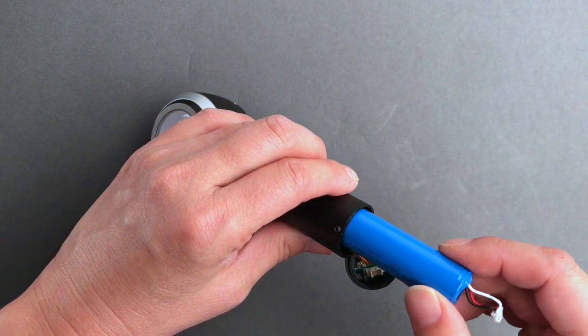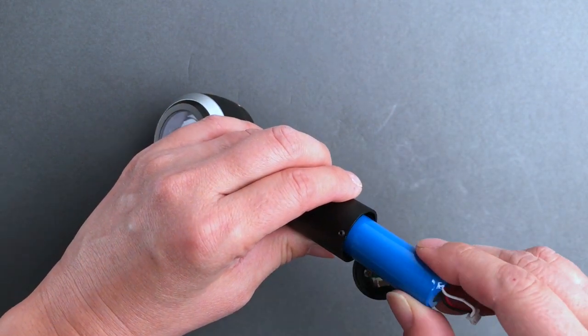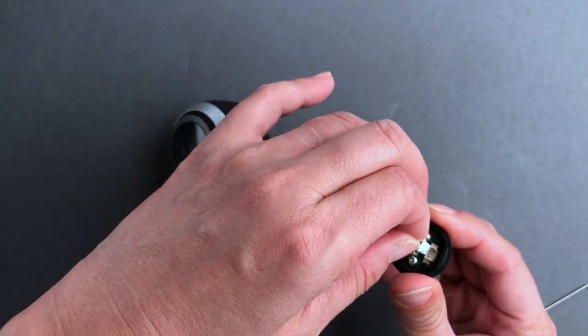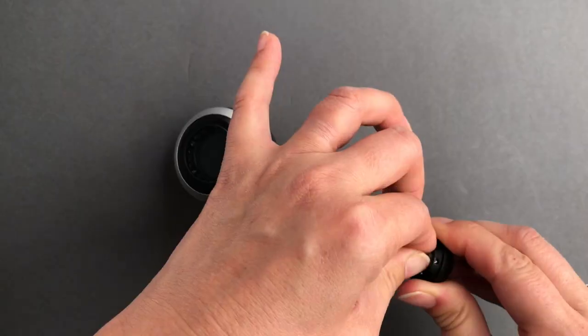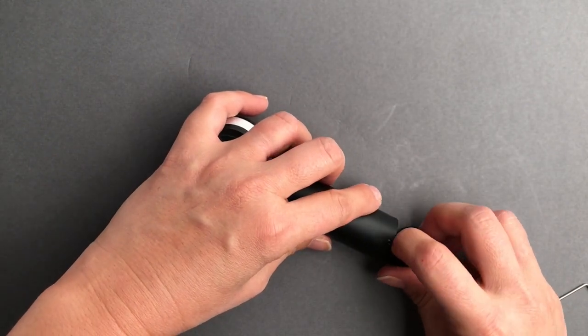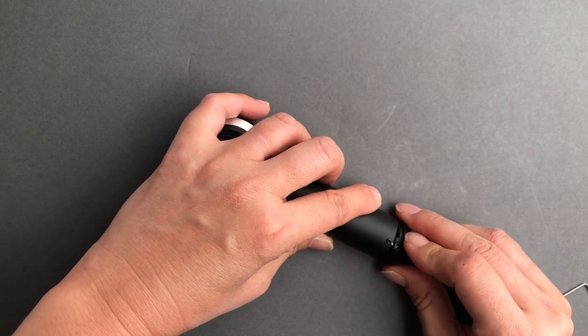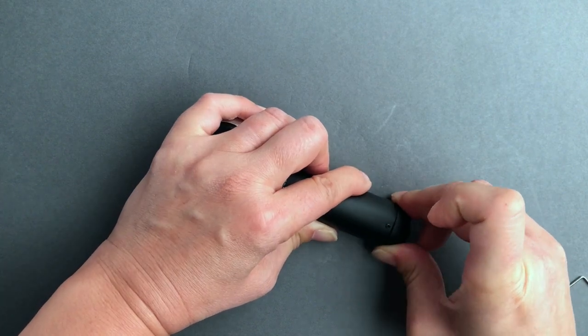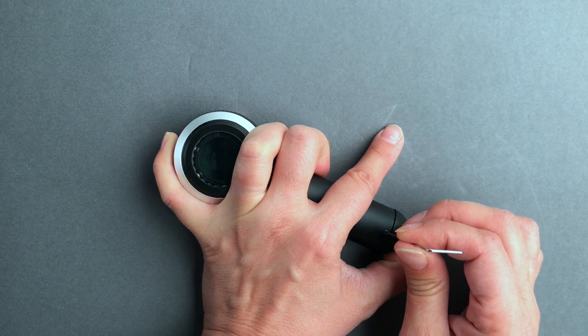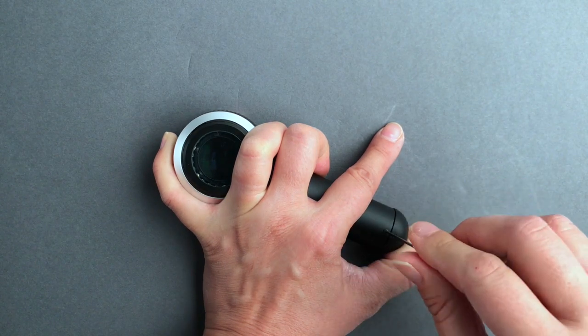Insert the new battery and reconnect the battery connector. Close the battery cap, making sure not to damage any wires. While pushing on the battery cap, tighten the set screw.